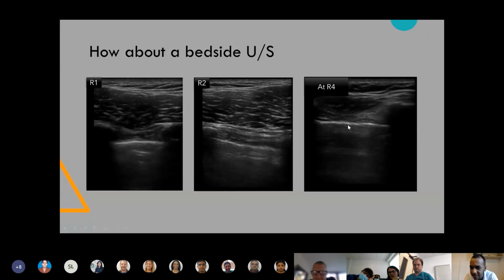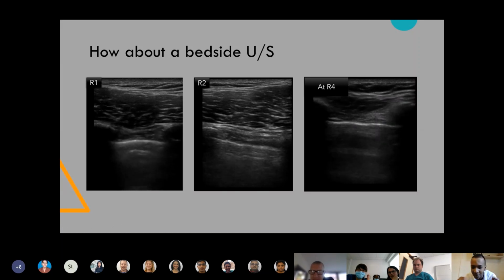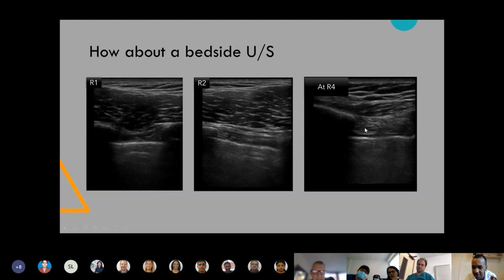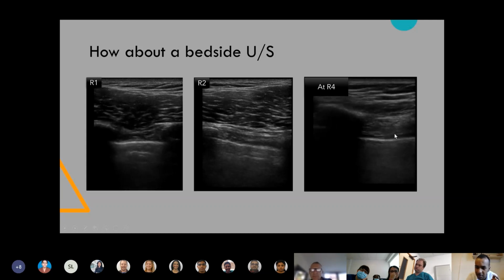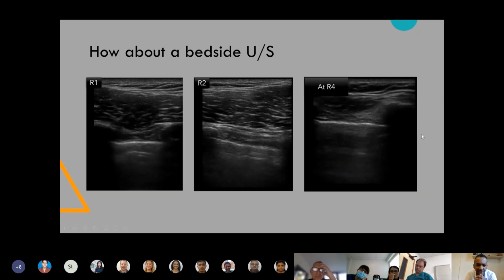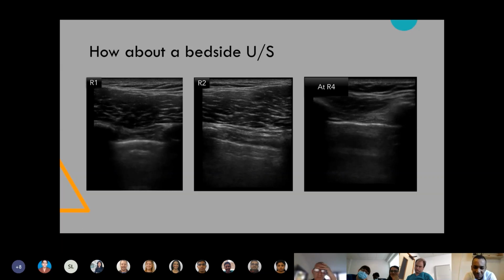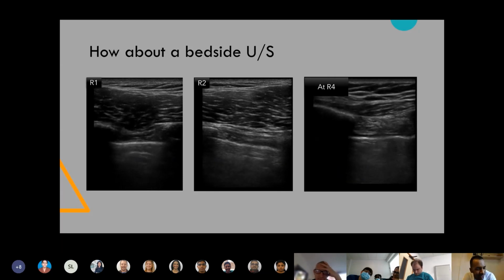What you can see here is the first time I saw a lung point. This is what you're seeing on this scan. This point, where there's sliding on one side and absent sliding on the other, is the lung point, and it is the start of a pneumothorax. Beyond this line is air and a pneumothorax. Then I was like, Yasir, are you really sure about what you have just imaged? This guy's x-ray is absolutely normal. What are you saying? I was thinking to myself, should I raise this further? What should I do?